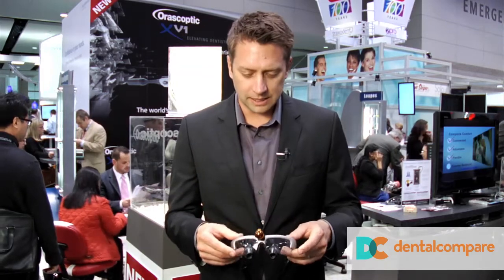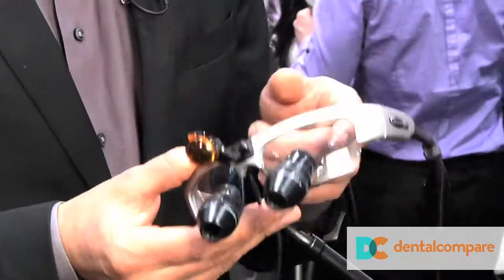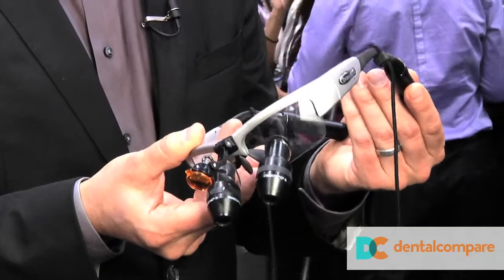Now, a lot of you might have a light that attaches to your loops that has a cord that gets tangled on anything, running down to a little battery pocket on the side of your belt. Well, this one has everything integrated right into the frame. You have the light with all the wiring on the inside of the frame that goes back to the battery pack on the back.